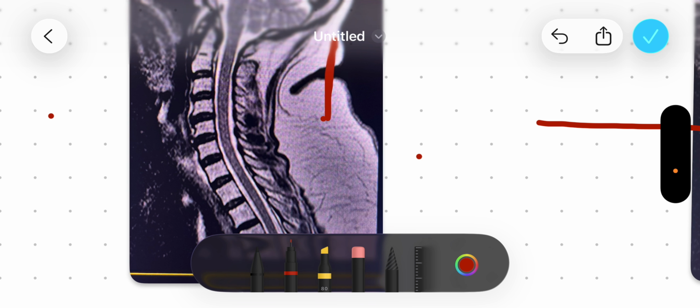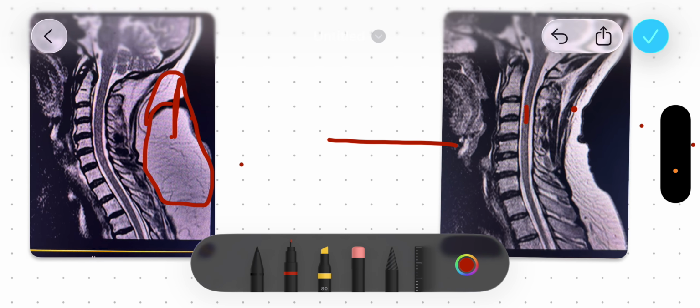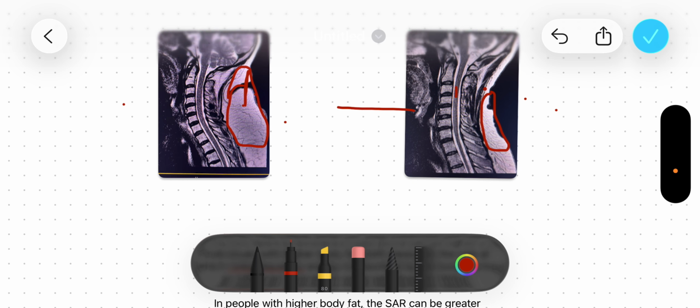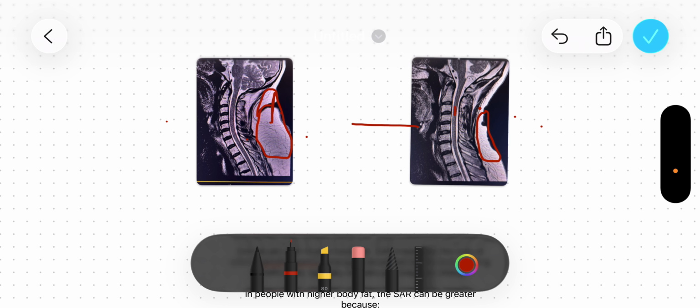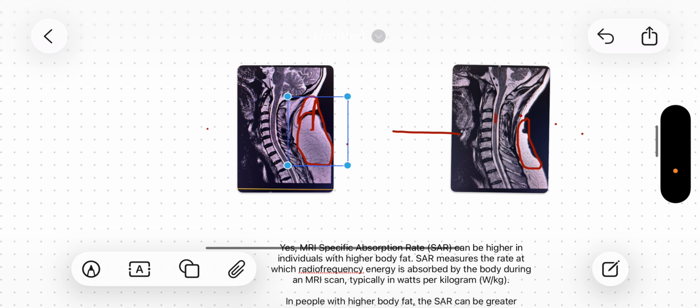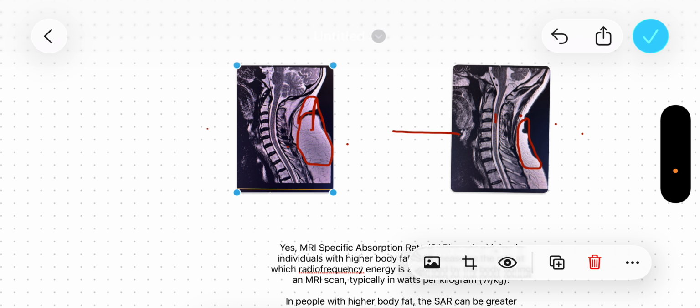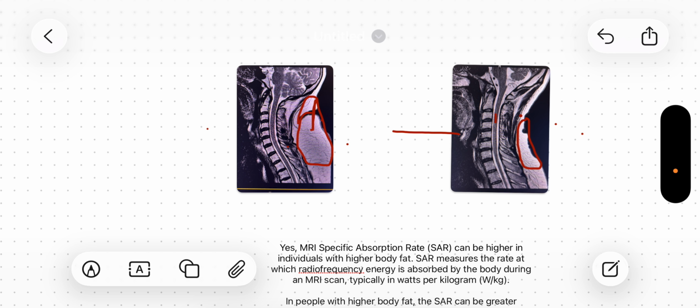The fat is right here. All this white stuff we're seeing right here, that's all fat. If you look at the one on the right, less fat. Okay, so look at that difference between the right and left. I'll place them together now. Well, that's not going to follow through, but as you can see, we have the big difference, and that is important for image quality in MRI.